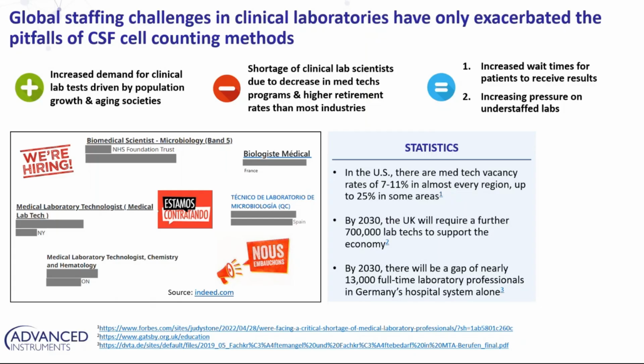So what does that result in? Increased wait times because patients' results take longer to get, right? And increased lab pressure, right? I'm sure everyone on this call is scrutinized on a daily basis and has so much work that it's hard to really focus on doing the best and getting the best results out in a timely fashion ultimately. And that's where GloCyte can help. And I have 3 case studies, if you'll indulge me real quick, that I want to go over that will just highlight the 3 main areas that GloCyte can provide value to your lab and your hospital.